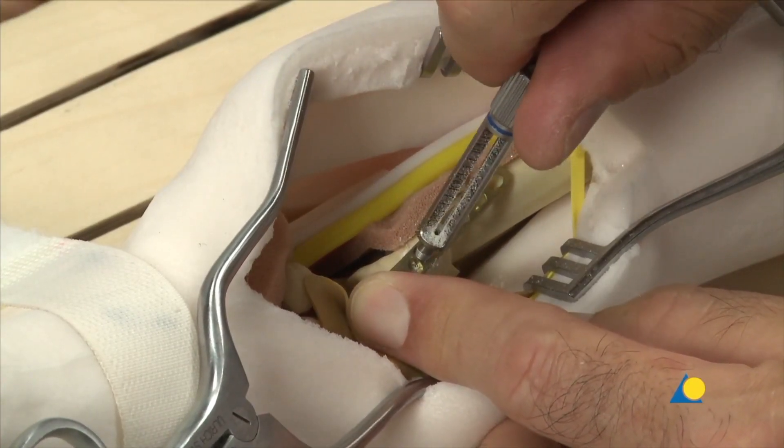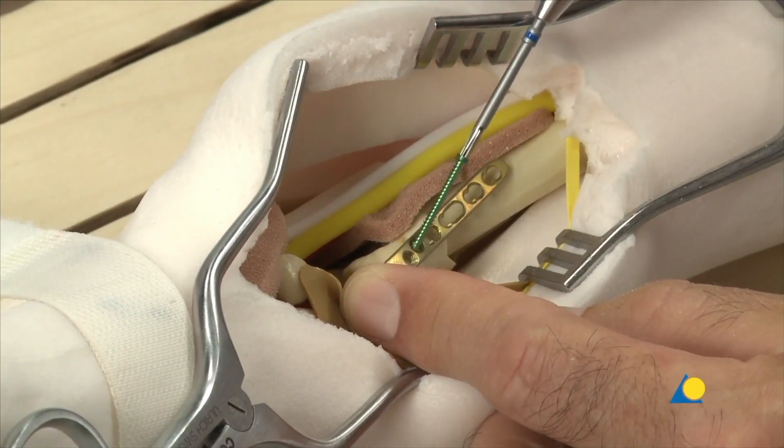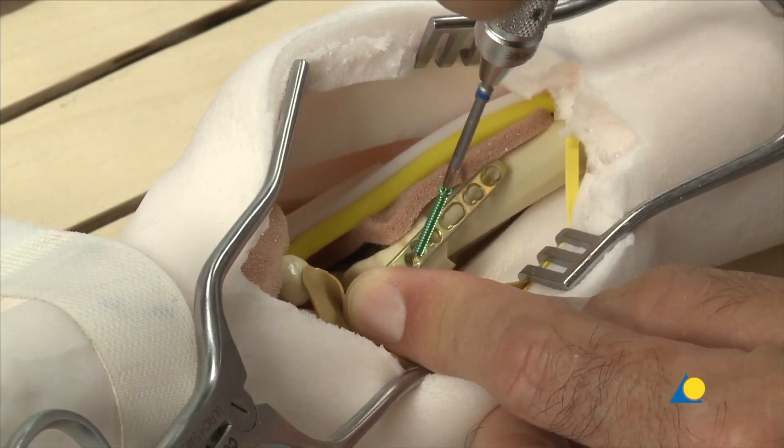The drill sleeve is removed and a 2mm locking screw of appropriate length is inserted with the short star drive screwdriver shaft with handle, and fully tightened.